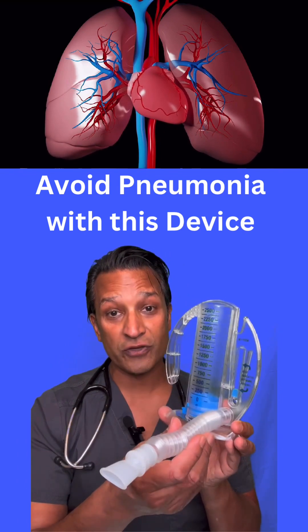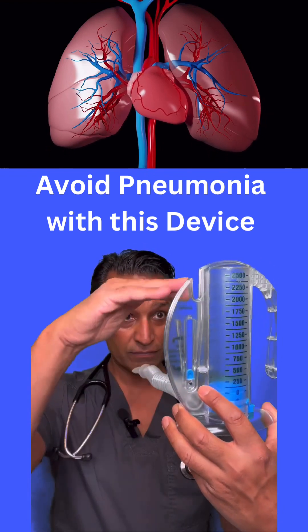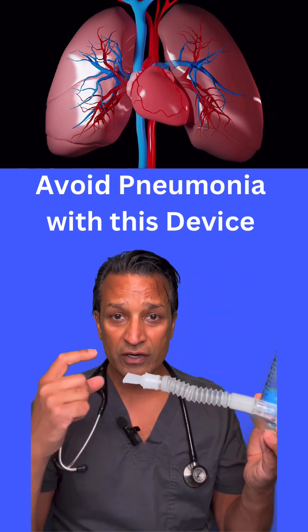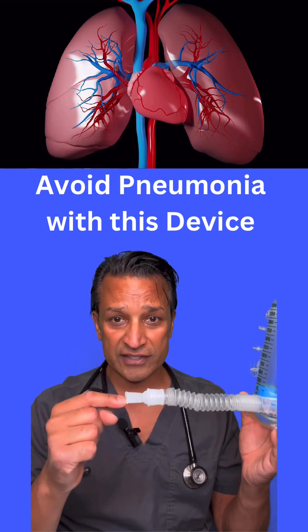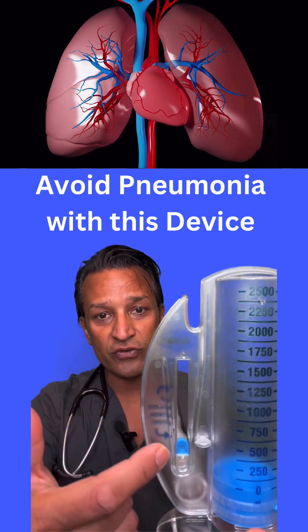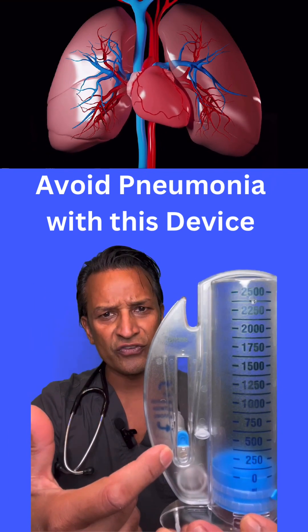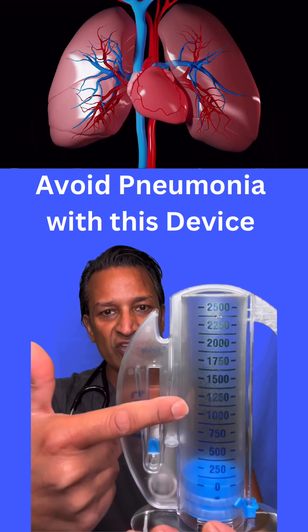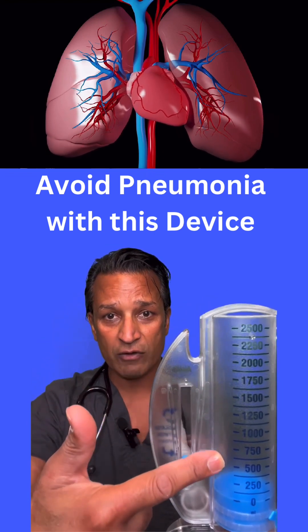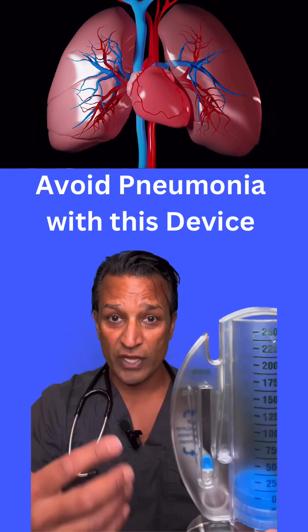So how do you use one of these things? You sit at the edge of a chair or bed, upright, and you want this to be held level right here. Before you put this in your mouth, you blow out all your air. You wrap your lips around here — don't put your tongue inside because that's going to block it. You'll see this indicator come up, but you want it to be between these two arrows. If it goes up too high, that means you're breathing too fast; if it stays down, you're breathing too slow. You want to see how high you can get this piston to go up, and once you get it as high as you can, you hold your breath, and the piston comes back down. Then you blow out and do it again — repeat that about eight to ten times.